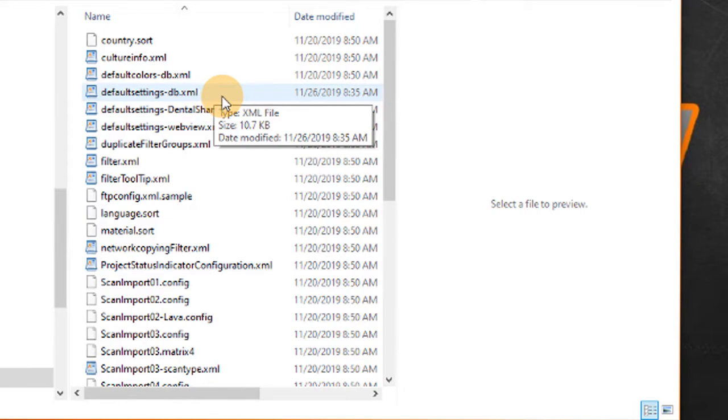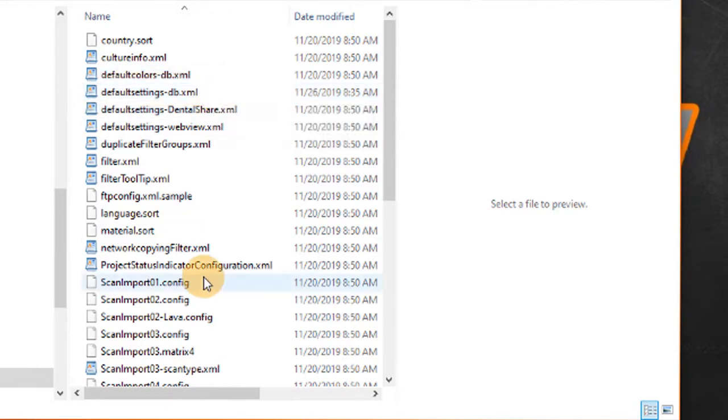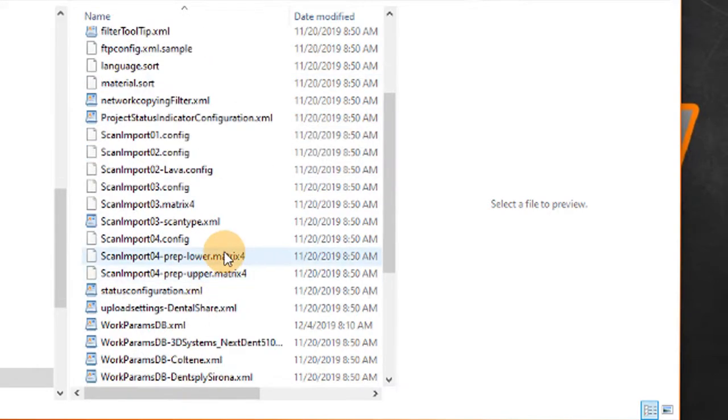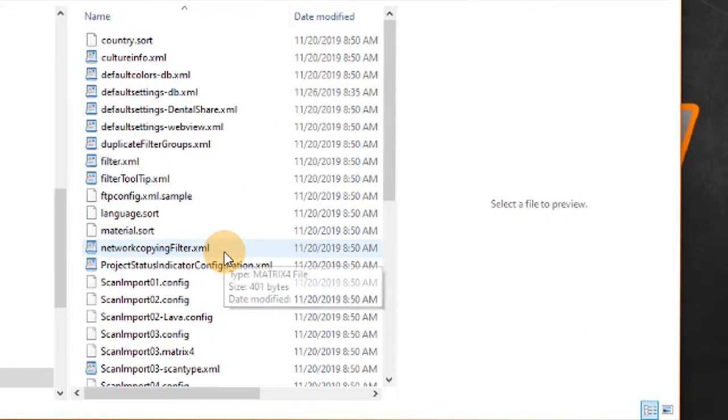Before we alter this I would suggest that you make a backup copy of this so just copy and paste this so you don't lose anything. You don't break ExoCad.